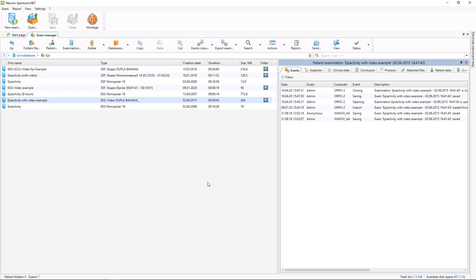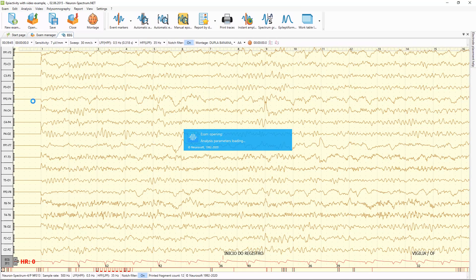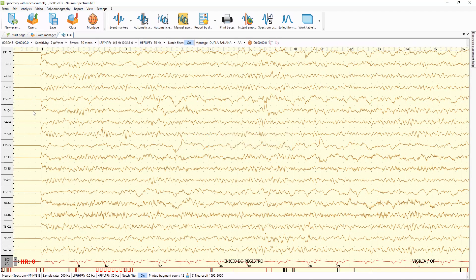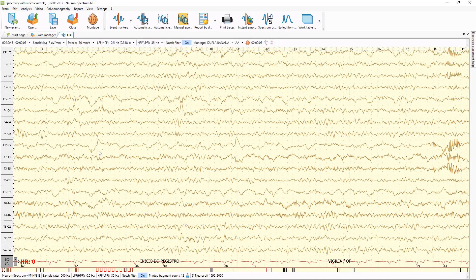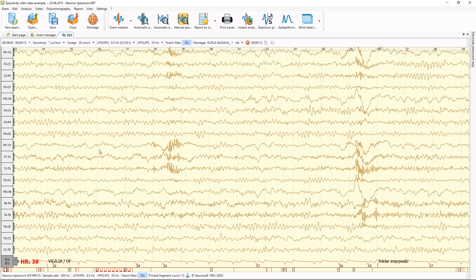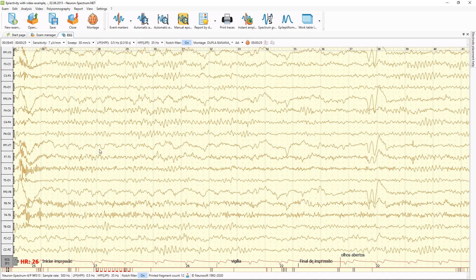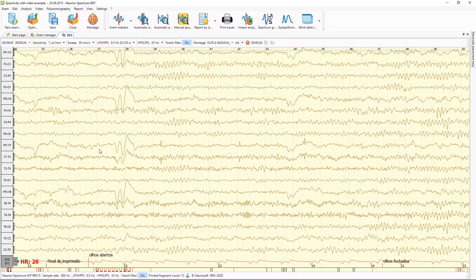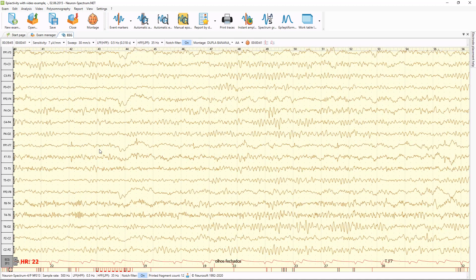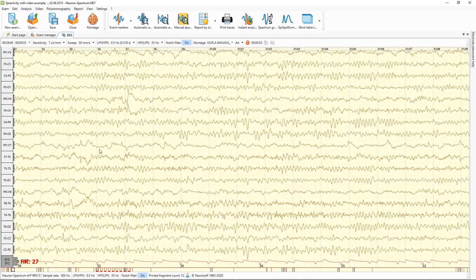Now let's try to open a selected examination with a mouse double click, and review and analyze it. Here is an EEG example with epileptiform activity.